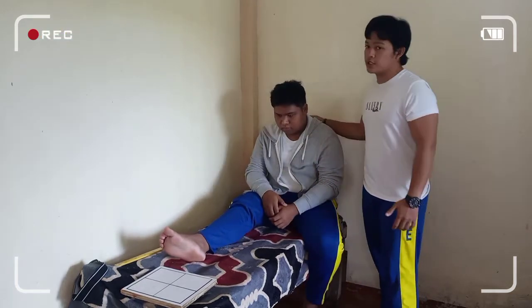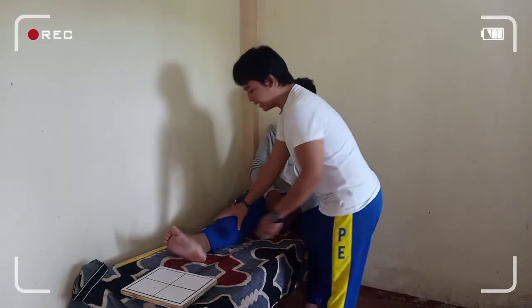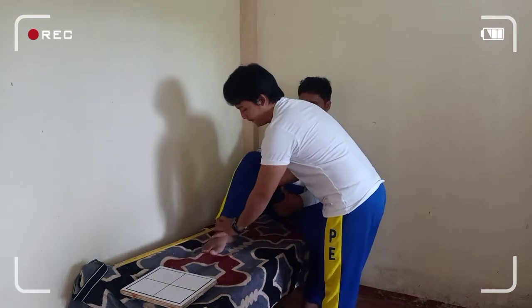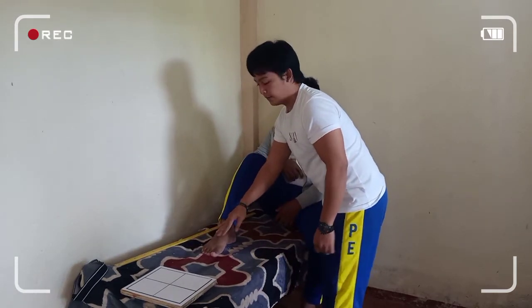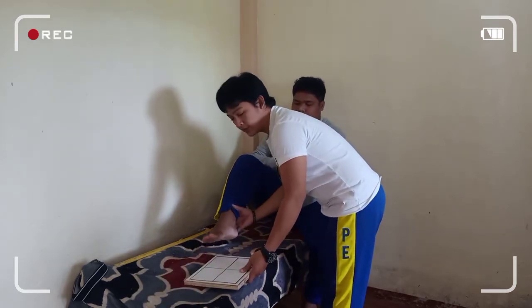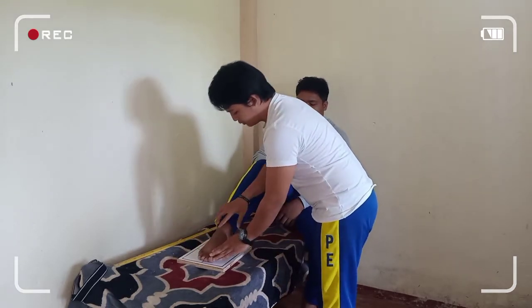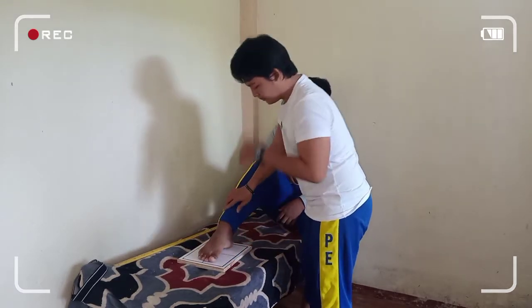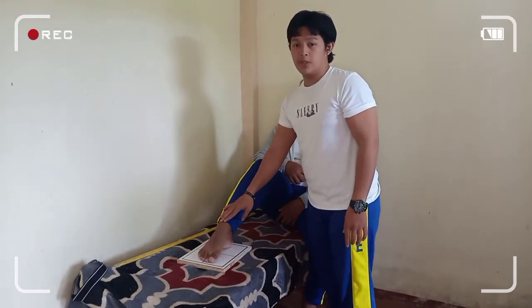First, place the patient seated or supine at the radiographic table and flex the knee on the affected side. Press the sole of the foot on the radiographic table, and center the plantar surface of the foot to the image receptor. Make sure that no rotation of the foot occurs.